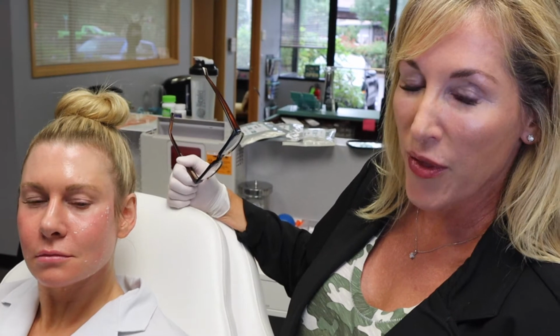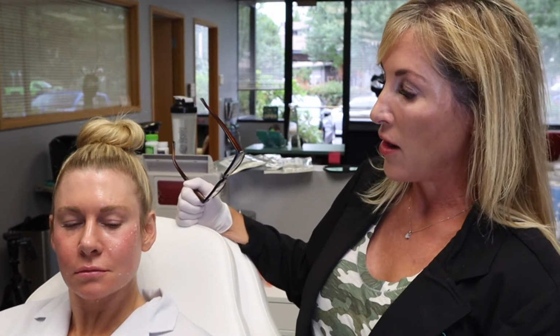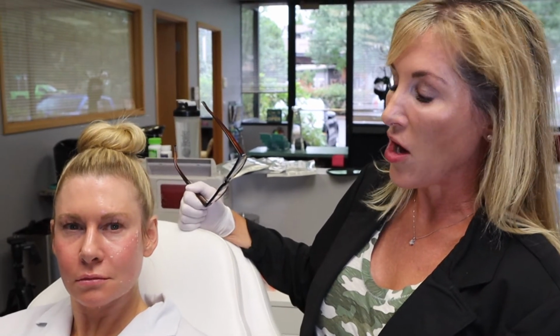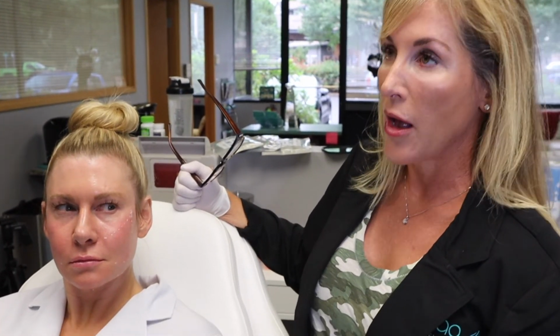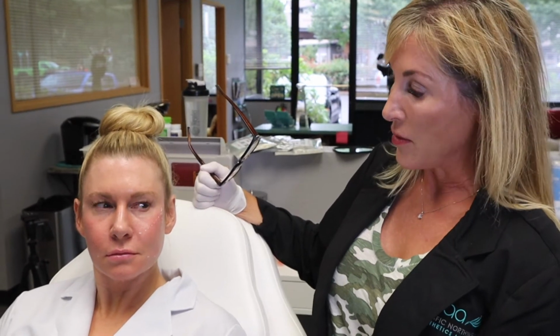She likes to have threads placed about every 6 months, which is ideal because at about the 6-month point, we start to see the skin laxity start to increase a little bit more, and we can start to see some collagen development that's ongoing. So keeping up with it, similarly to how you would keep up with your dermal filler, is recommended with PDO threads. So I will show you the rest of the procedure and talk through the steps.